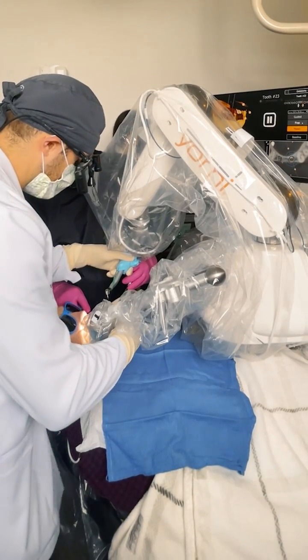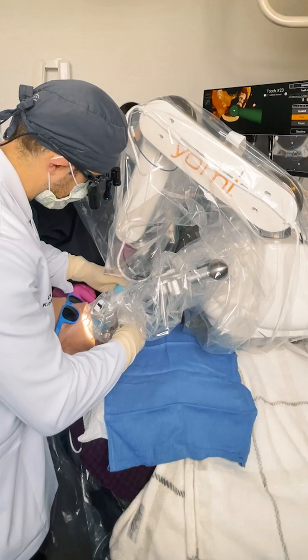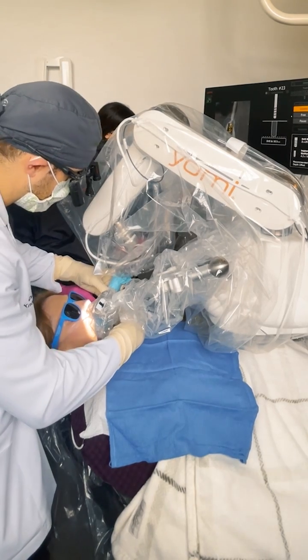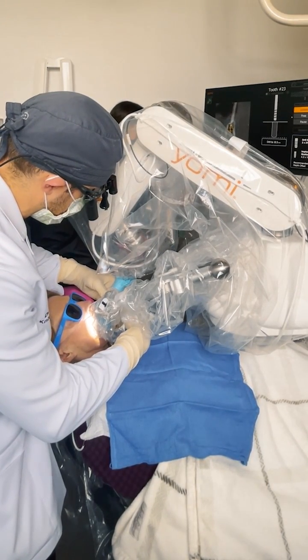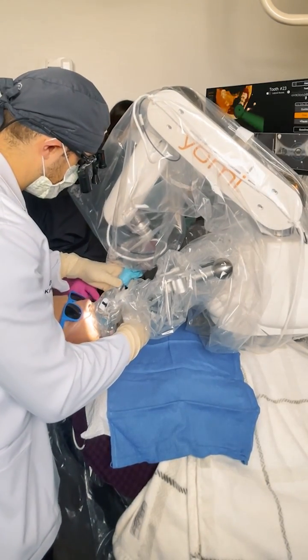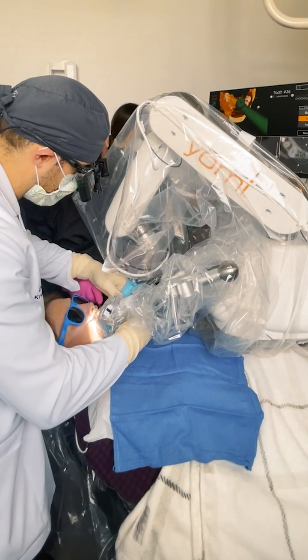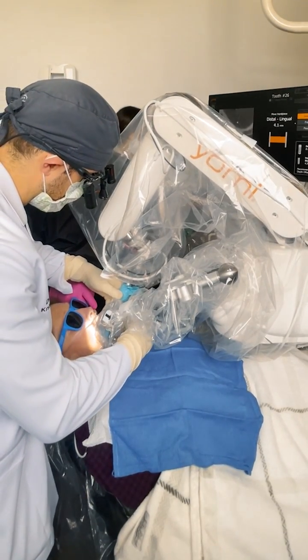Go ahead and start 23. Freeze. Got it. Freeze. Slow down. Walk in. Okay. Good. Six. Freeze. Good. Freeze. Ready? Okay. It's going here.